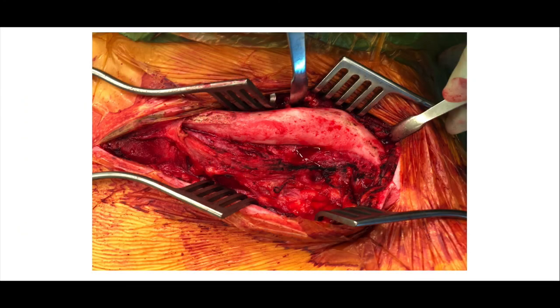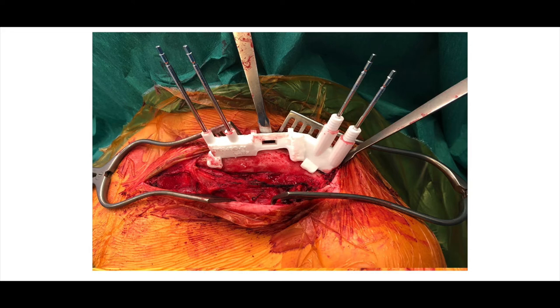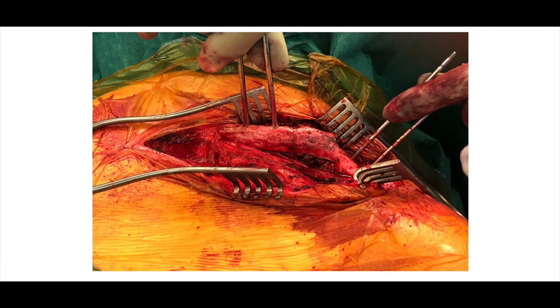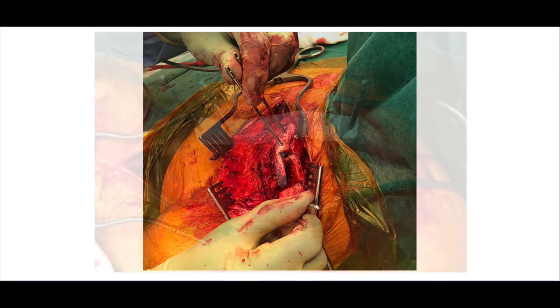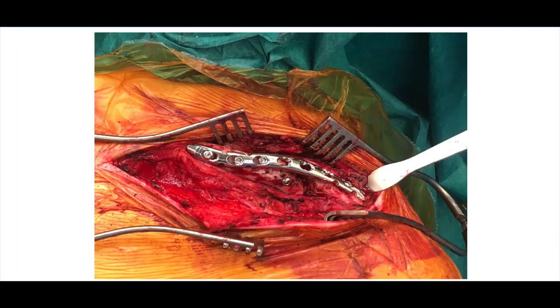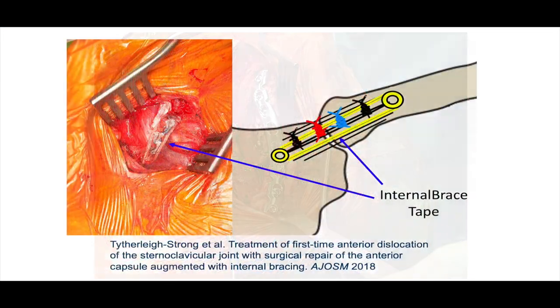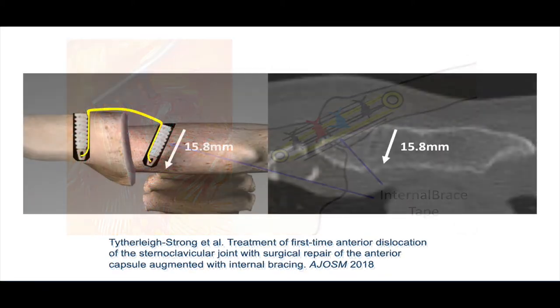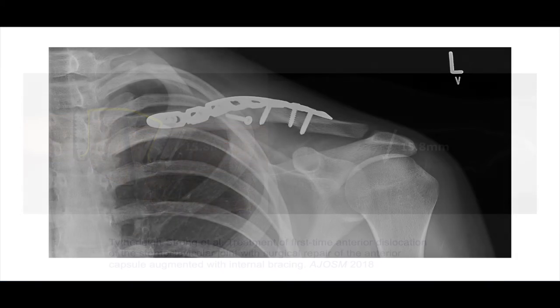This is the operative exposure of the clavicle. The osteotomy jig has been positioned and held in place with the Steinmann pins. The osteotomy has been performed and the Steinmann pins are being manipulated into the reduced position. The reduction jig is then positioned, the lag screw inserted, and the contoured plate applied. A repair of the anterior sternoclavicular joint capsule is then undertaken, protected with an internal brace using the technique that we have previously described.